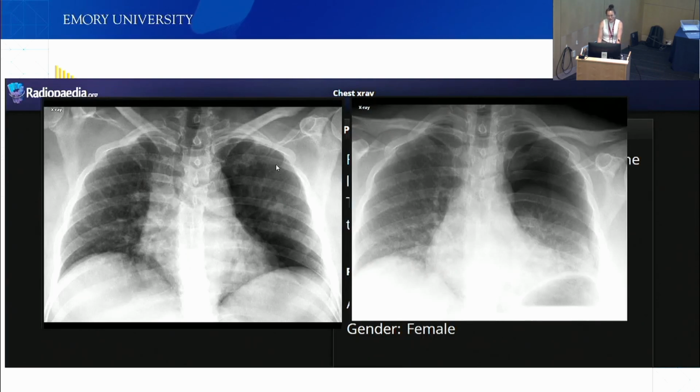So you can see here, I'm going to tell you, a pneumothorax. They're done in 2 different positions. So it's a supine one, and an erect one. Here, it's a very subtle pneumothorax. Here it isn't. You can see here there's no lung markings. This is the line. So based on this one, they were saying, hey, this is a very small one, but let's do another X-ray standing. And they saw, oh, this is big enough to put a drain in. So based on the first X-ray, they didn't think they needed a drain. They put in a drain because of this X-ray.